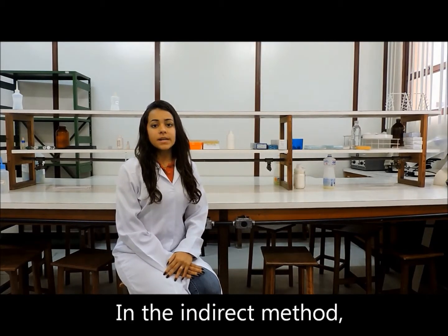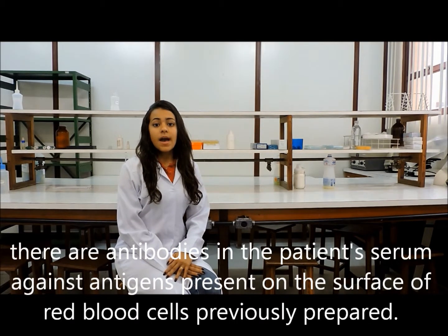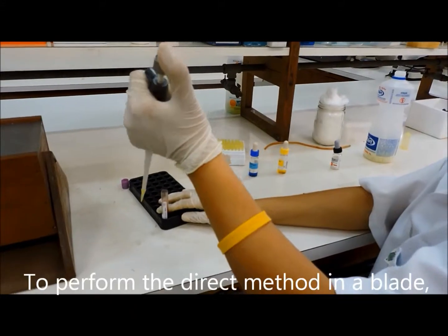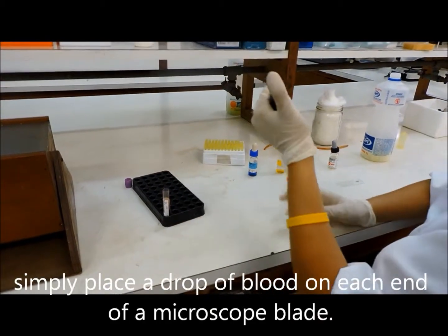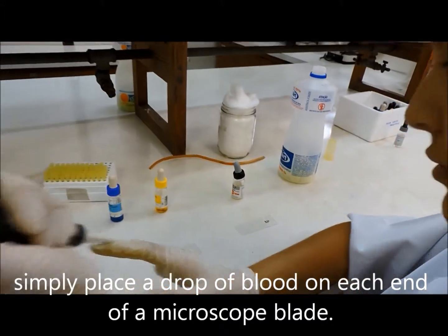In the indirect method, there are antibodies in the patient's serum against antigens present on the surface of previously prepared red blood cells. To perform the direct method on a slide, simply place a drop of blood on each end of a microscope slide.